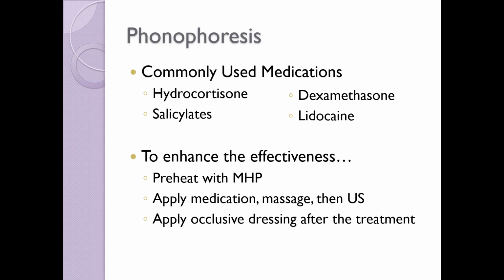For treating orthopedic injuries, the most commonly used medications in phonophoresis are either anti-inflammatories, such as cortisol, hydrocortisone, salicylates or dexamethasone, or analgesics such as lidocaine. Preheating the treatment area with a moist hot pack to increase local blood flow and kinetic energy can further enhance the delivery of the medication.